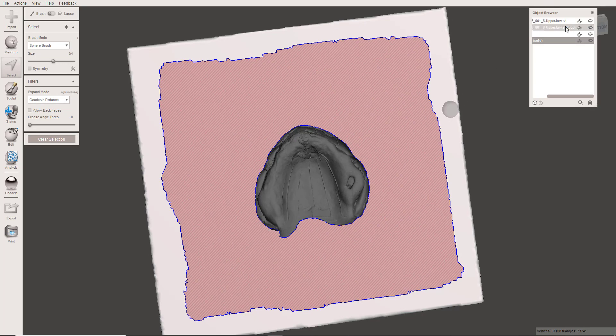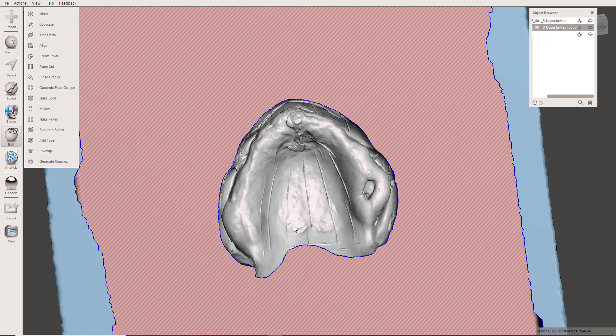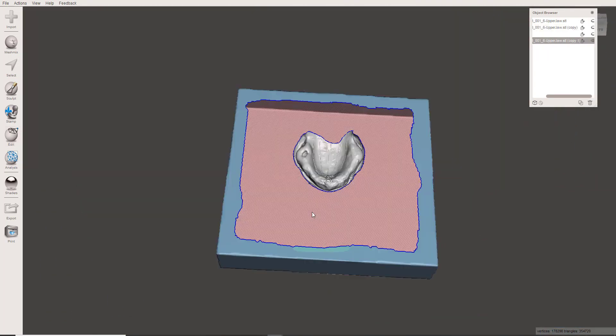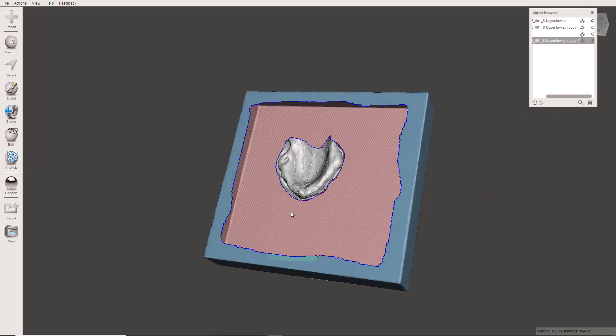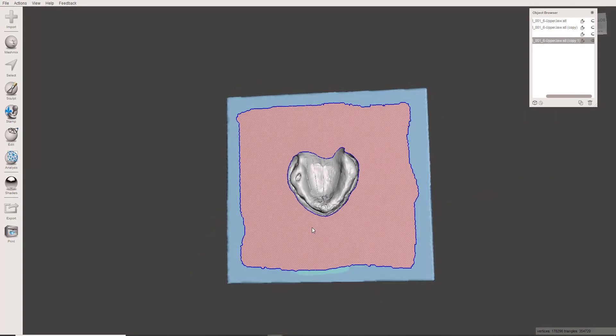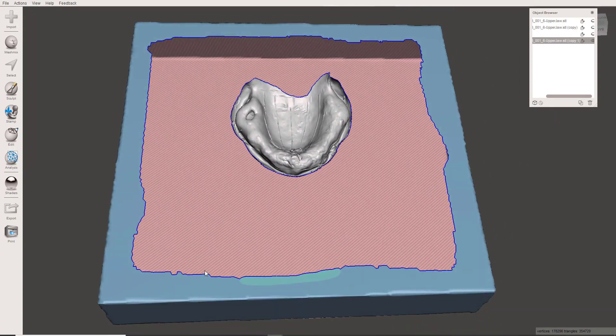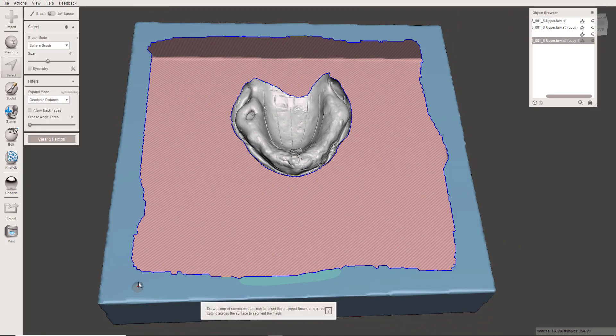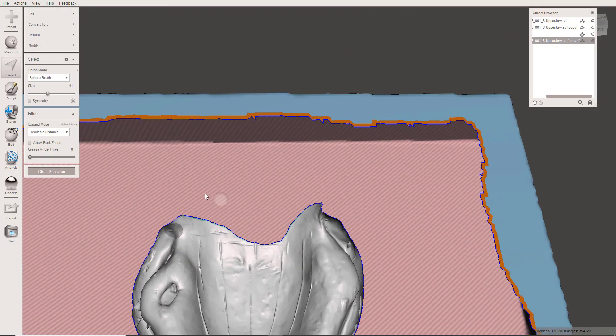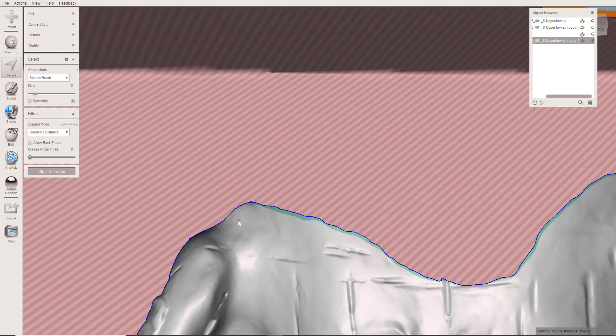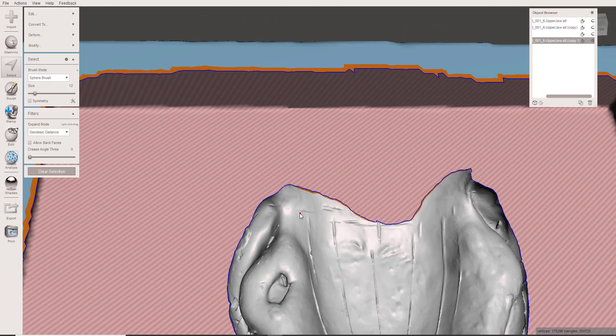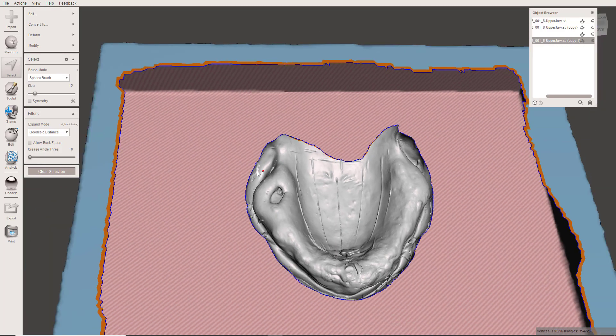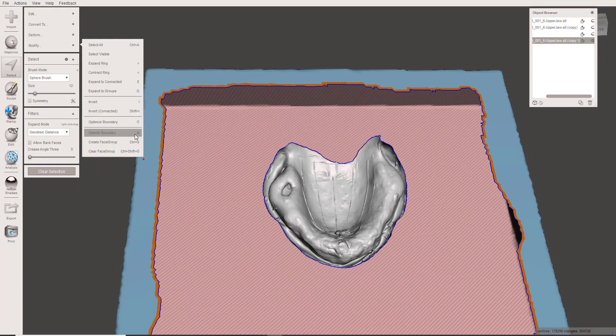You're going to start by combining these models. You've got to have them as a single STL. You see the model now, and we have joined these two things together. So what I'm going to do now is come over with the Select tool, and I'm going to select this portion of the boundary, and then using a small piece so I don't mess up this mesh, I'm going to come and select that one. Let's go ahead and make sure we optimize those boundaries and smooth those boundaries.